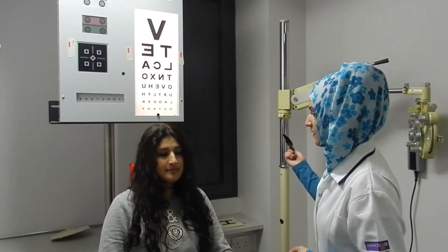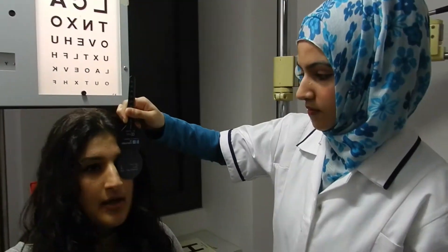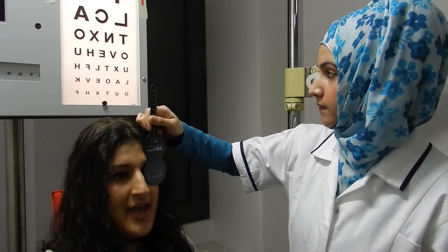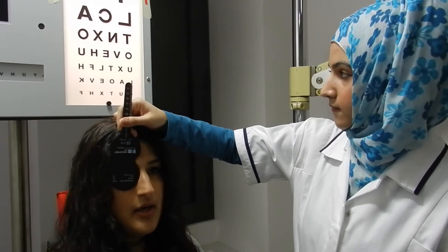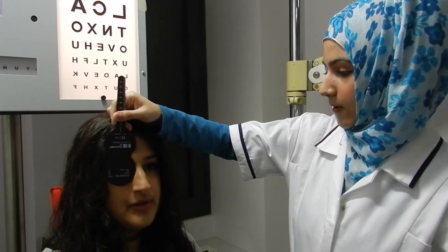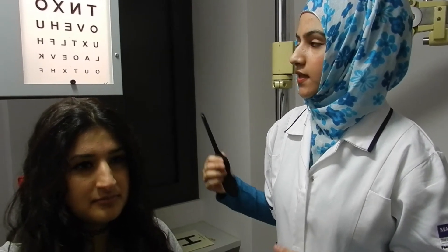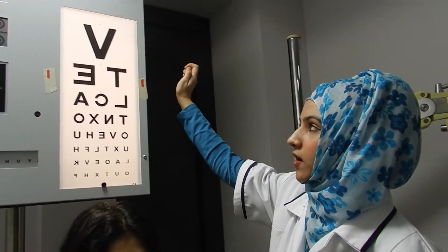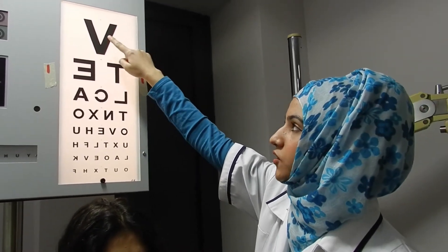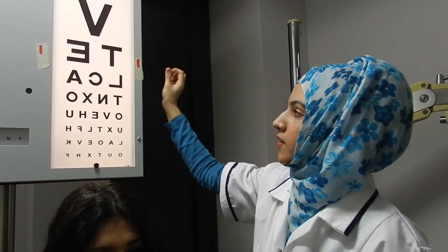I'm going to begin by testing your vision without the glasses. What is the lowest line you can read? O-Y-E-N-U. And with this eye? O-V-E-H-U. The patient can only read 6/9, and in the cover test, if the vision is worse than 6/18, we have to go to the top letter of the chart and tell the patient to look at the limb of the letter or a particular area to fixate.